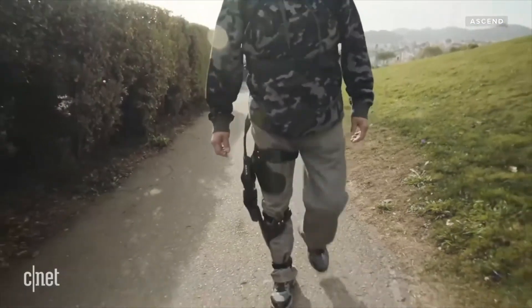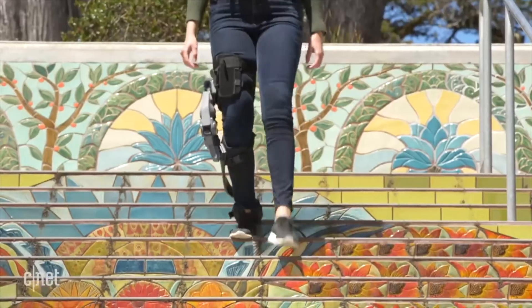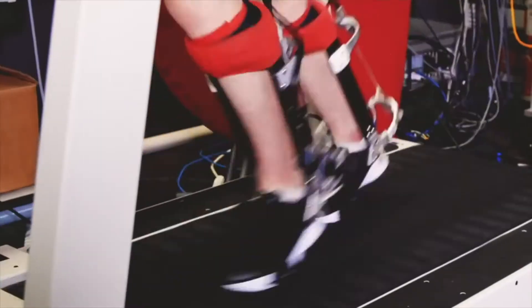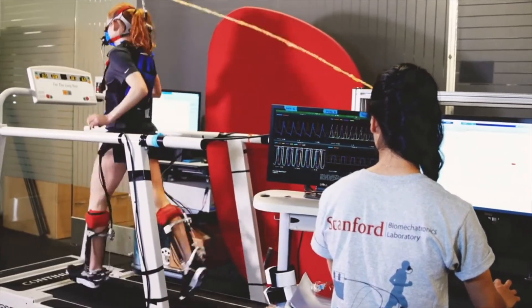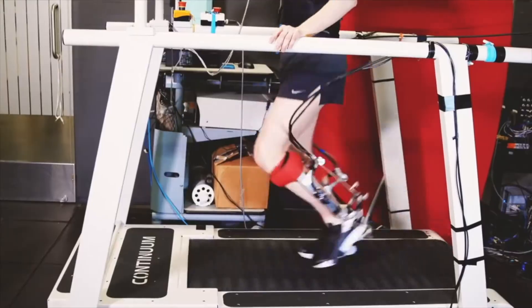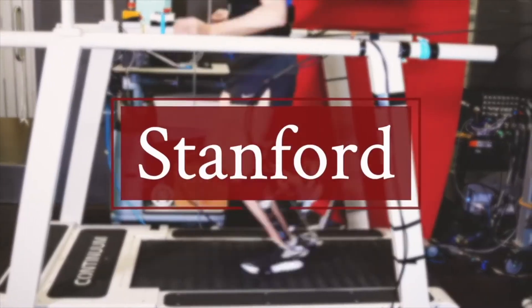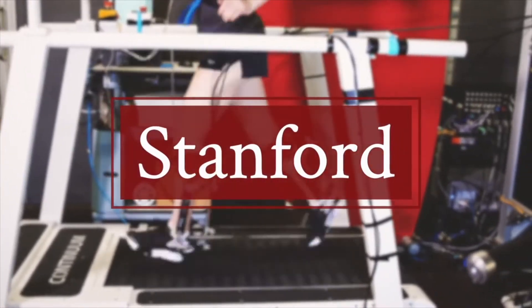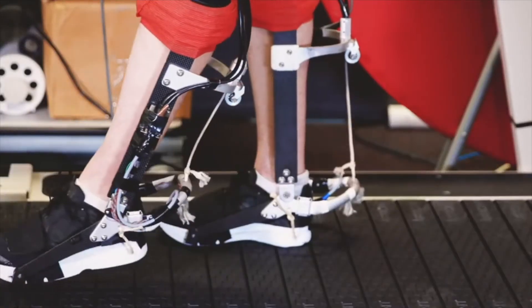Ascend is a knee brace from Rome Robotics that can support the knee joint and reduce the pain associated with it, helping people with osteoarthritis to regain their mobility. The ankle joint plays an important role in human activities such as standing, walking, and sitting. For example, Stanford researchers have developed an exoskeleton to support the ankle joint, and they showed that this motorized device can greatly reduce the energy cost of running.